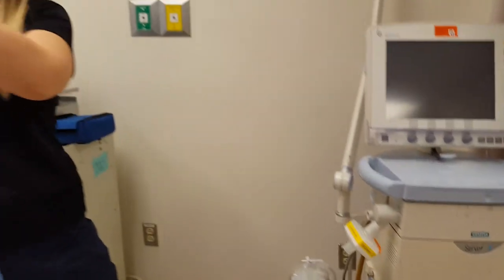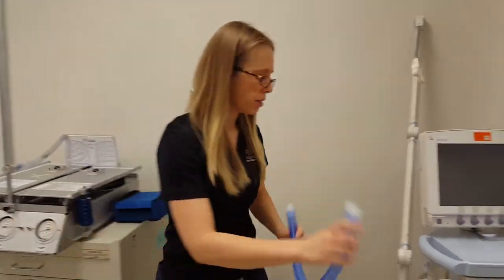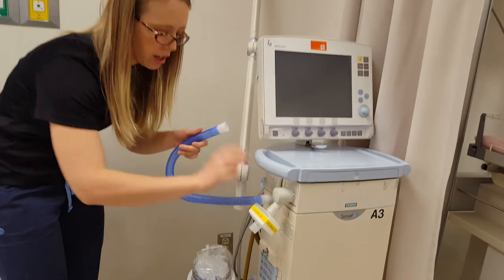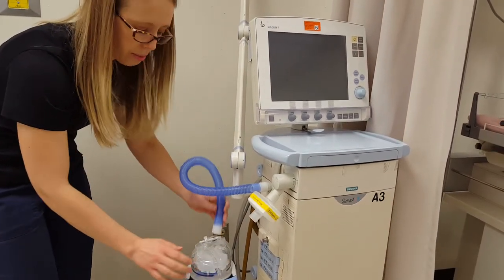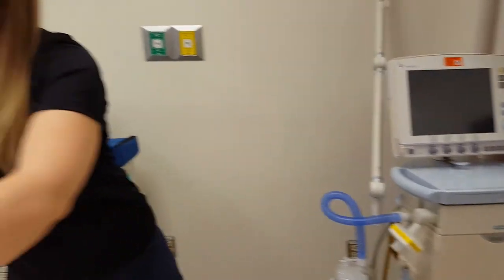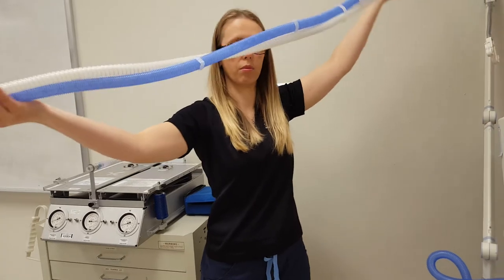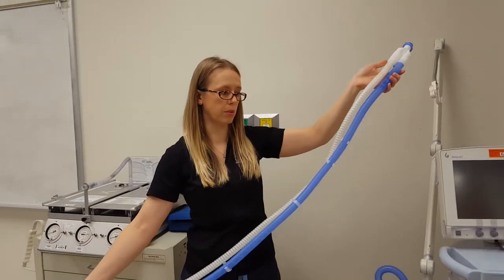On your circuit, you'll have a short limb that doesn't have any heated coils inside. This goes on the inspiratory side on either side of the heater basin — it doesn't matter which side. Then pull your circuit, which has two limbs: inspiratory and expiratory. Blue is inspiratory and white is expiratory.